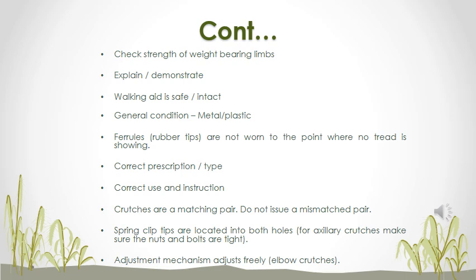And also prescribe the correct walking aid. Make sure the type fits your patient. So for a fit, strong 18-year-old, you are not going to give him a walking frame. He's going to laugh at you, and he actually will cope better with crutches. And you should be able to correctly show them how to use it. So be sure to give clear, concise instructions.